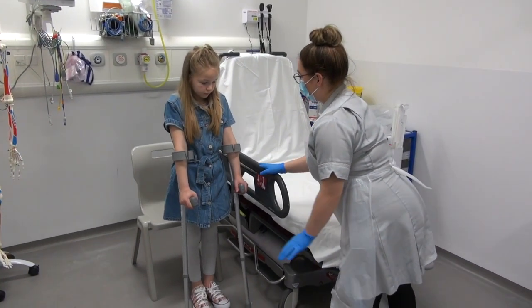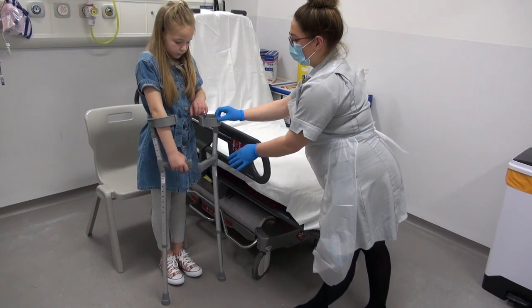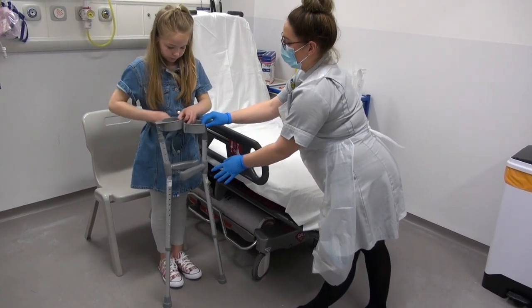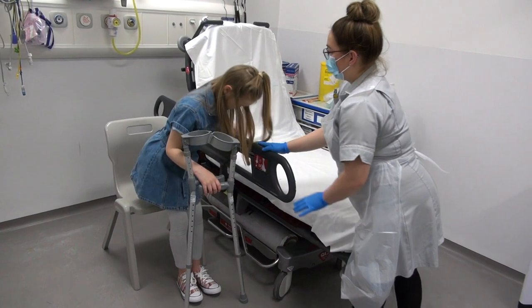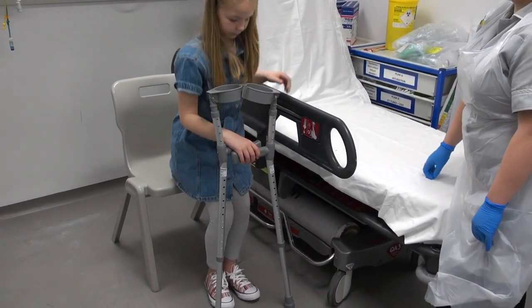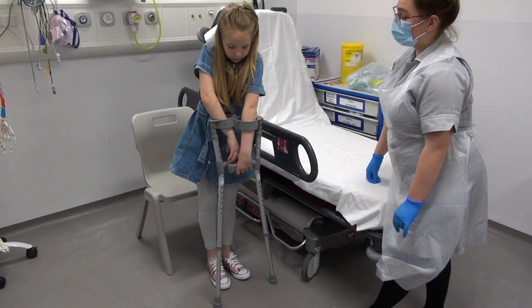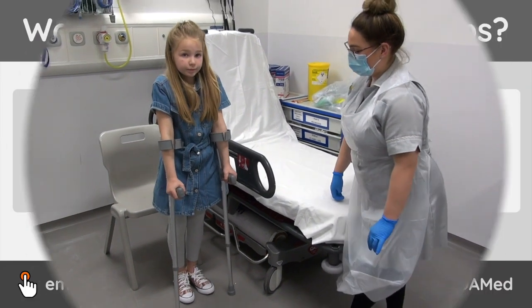You've got the rail to hold on to. So take your left arm out first. That's it. Perfect. And then hold it together in an H-shape, and then hold on to the side. Perfect. And then stand up before you put your arms back in.